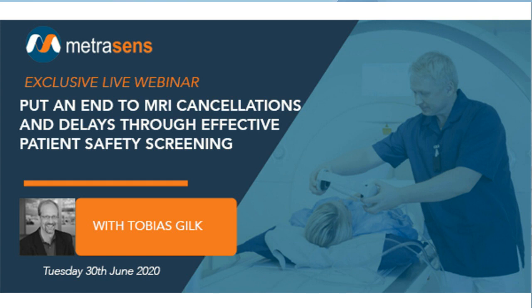If the BB is very close to a sensitive structure, a critical vessel, critical nerve, now all of a sudden the potential harm goes up, because from a proximity standpoint, there's a greater potential for injuring an important structure.